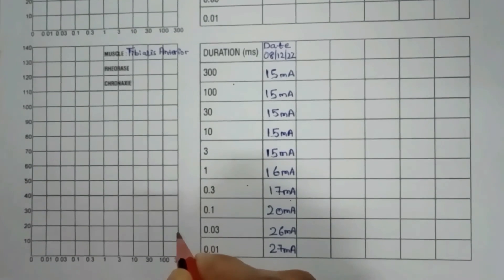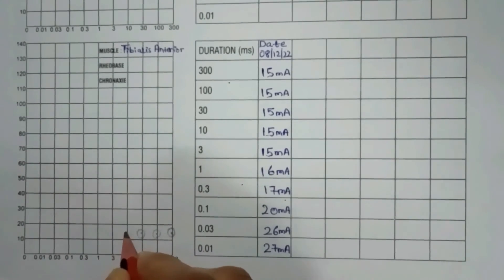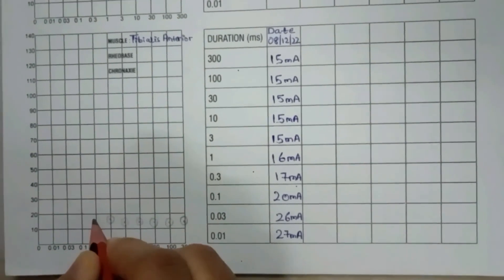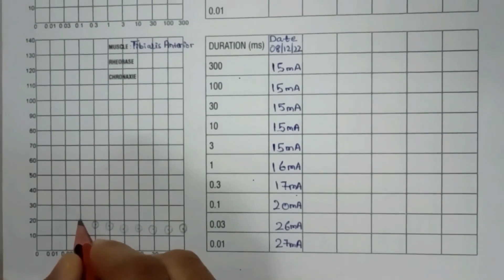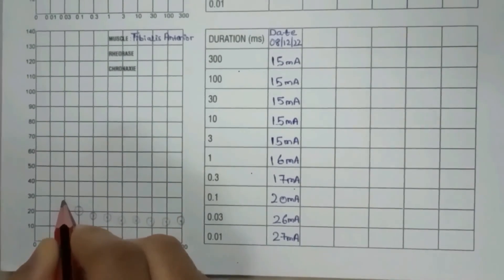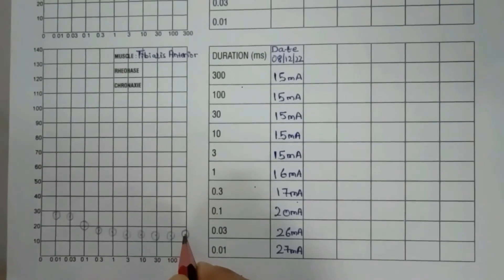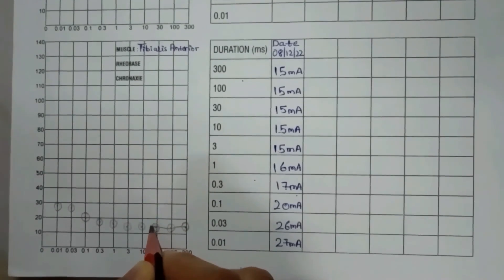SD curve data for tibialis anterior: at 300 ms, 100 ms, 30 ms, 10 ms, and 3 ms, response is obtained at 15 mA. At 1 ms, response is at 16 mA. At 0.3 ms, response is at 17 mA. At 0.1 ms, response is at 20 mA. At 0.03 ms, response is at 26 mA. The points are then connected to draw the SD curve graph for tibialis anterior.